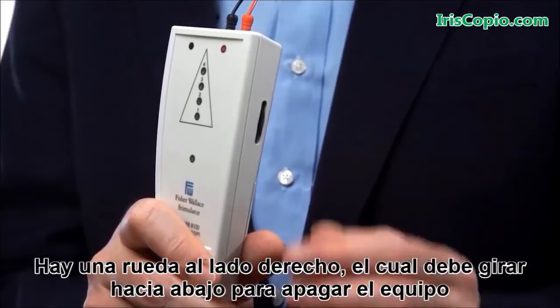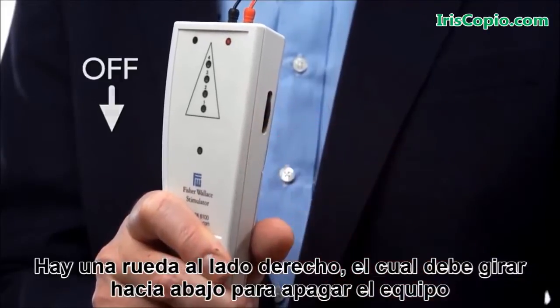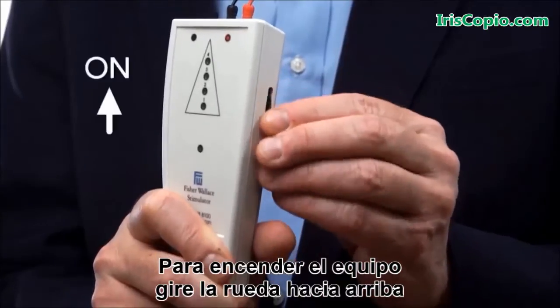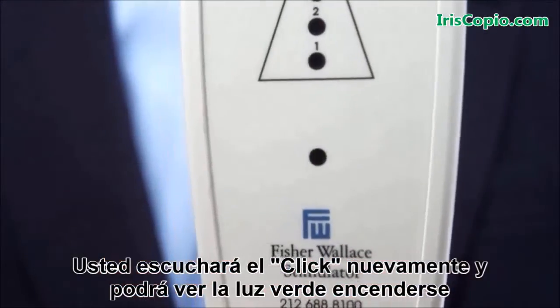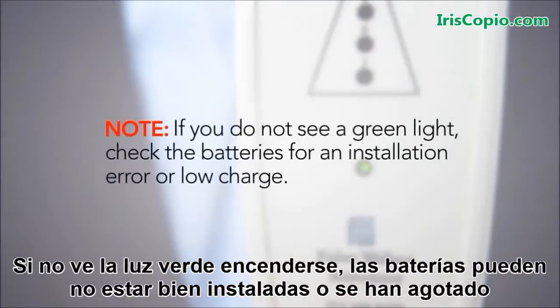There's a wheel on the right side of the device that should be turned clockwise to the off position — you'll hear a click when the device turns off. To turn the device on, turn the wheel counter-clockwise. You'll hear the click again and you'll see the green light come on. If you do not see the green light come on, either the batteries are not installed properly or the batteries have been depleted.